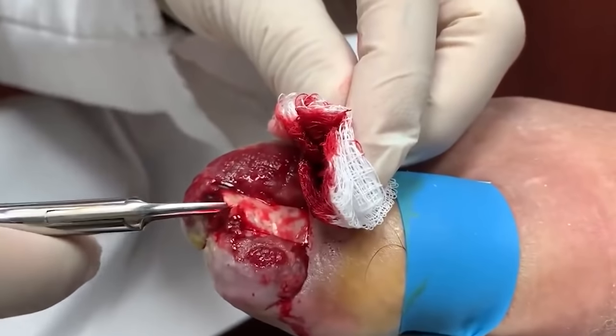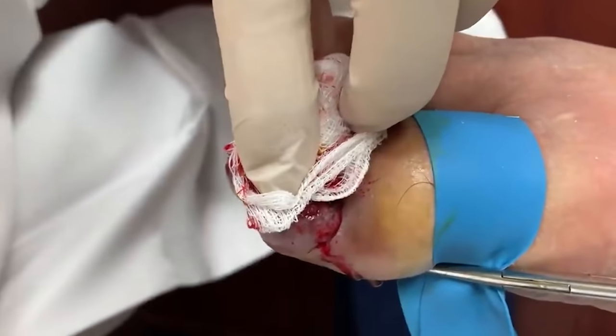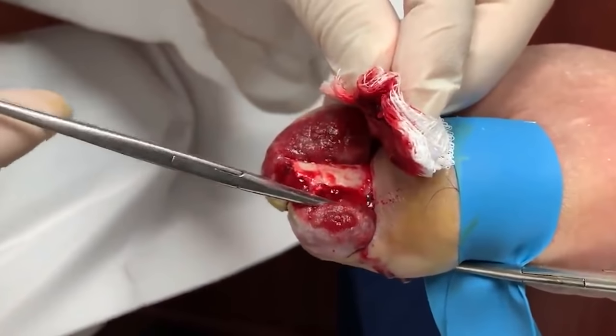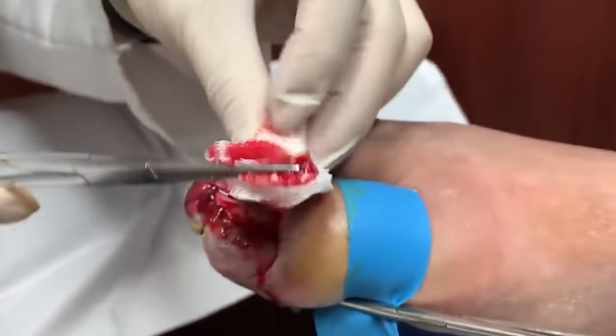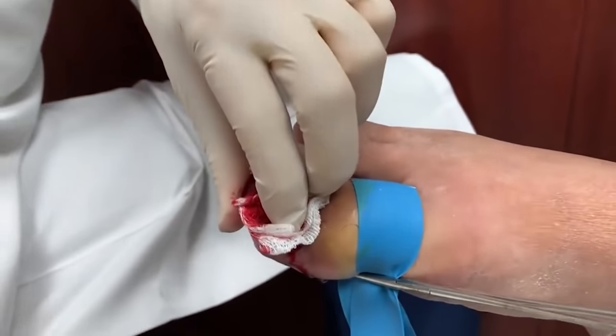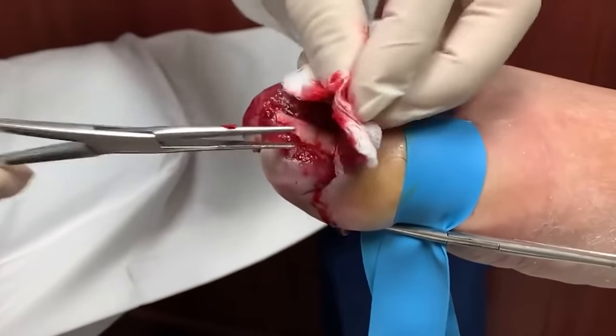I may have to remove this whole thing for now but we'll see. I don't want to overdo it today. That's one of the nails here — it's a pretty big piece sitting in there that's causing that granuloma — and then we have the other side.